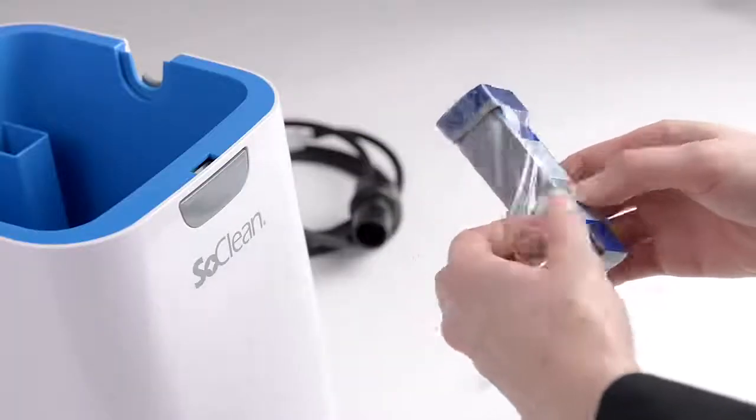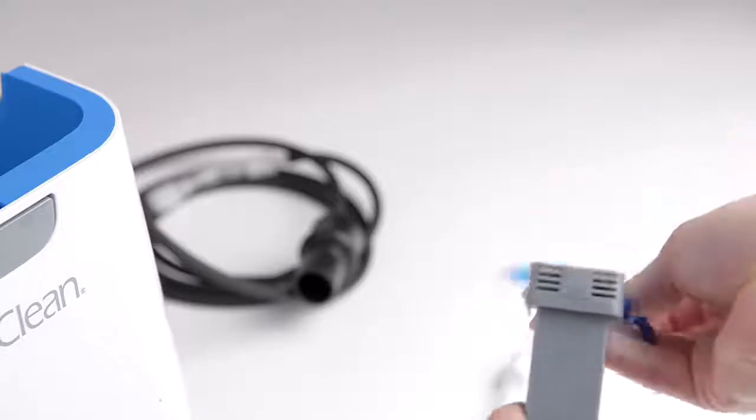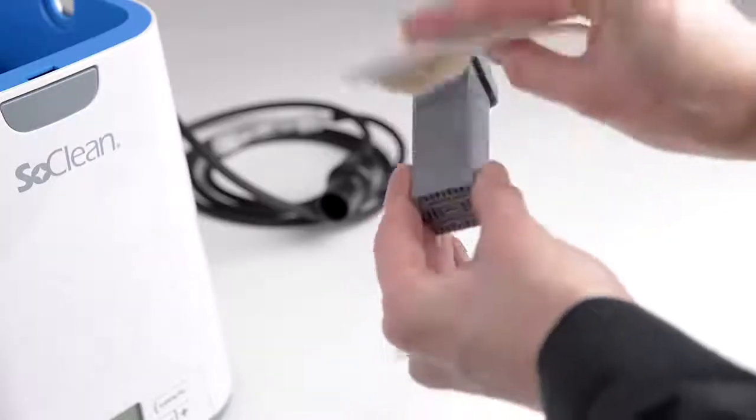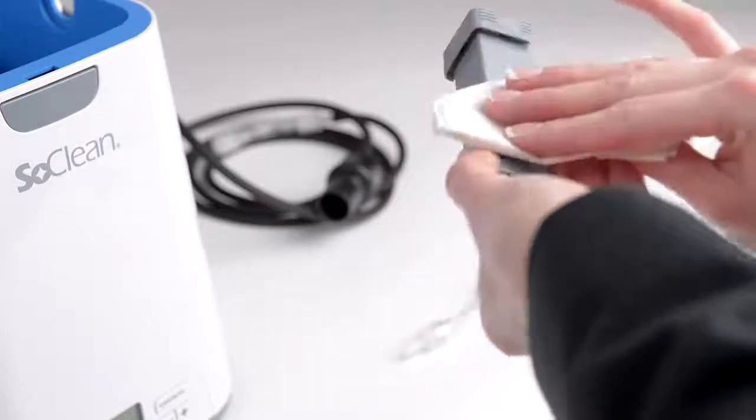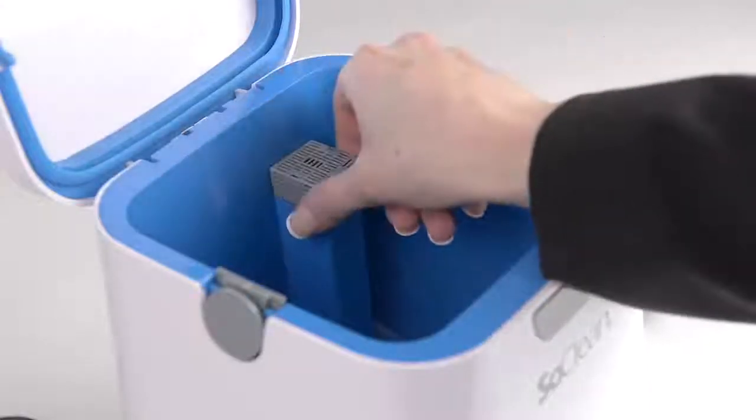Remove all protective plastic and tape from the new filter. You may see some black particles on the filter or on your hands. This is normal from the settling during shipping and can be wiped off. Place the new filter into the SoClean.